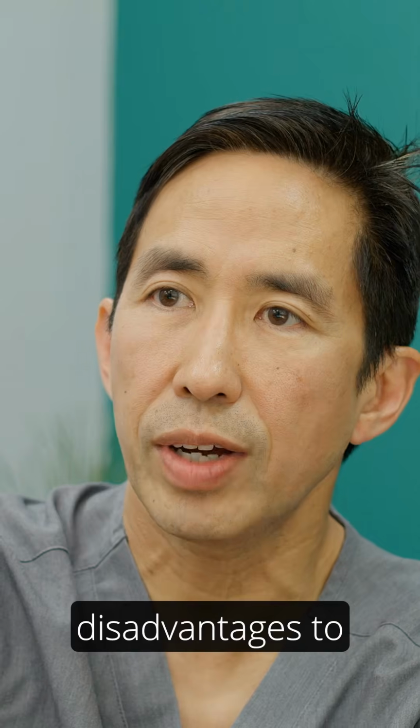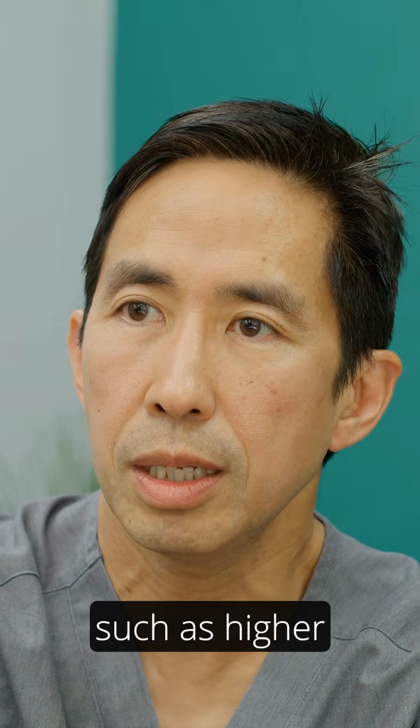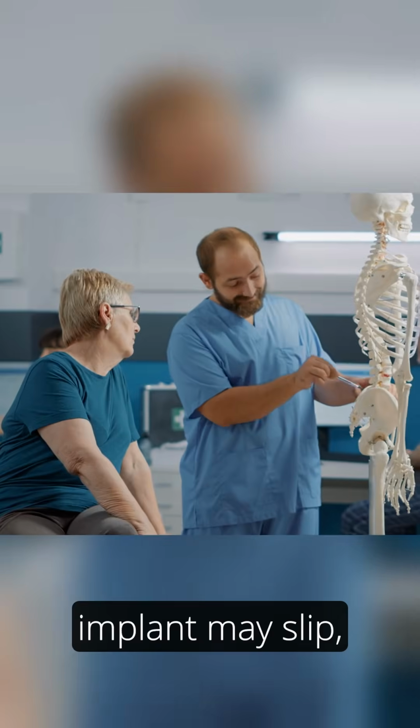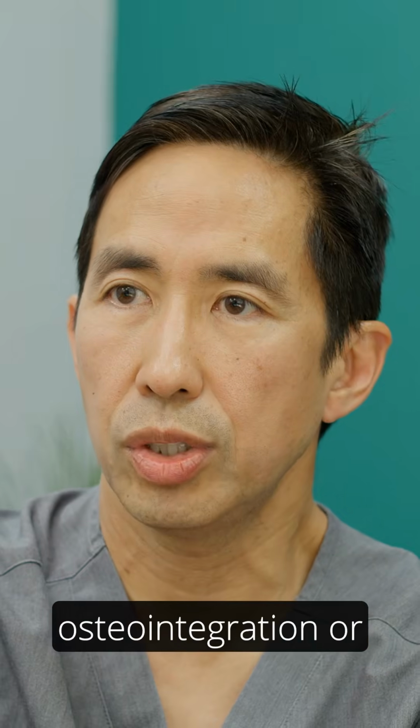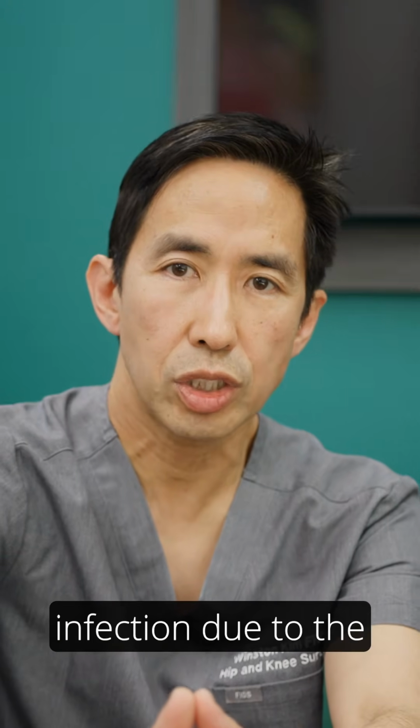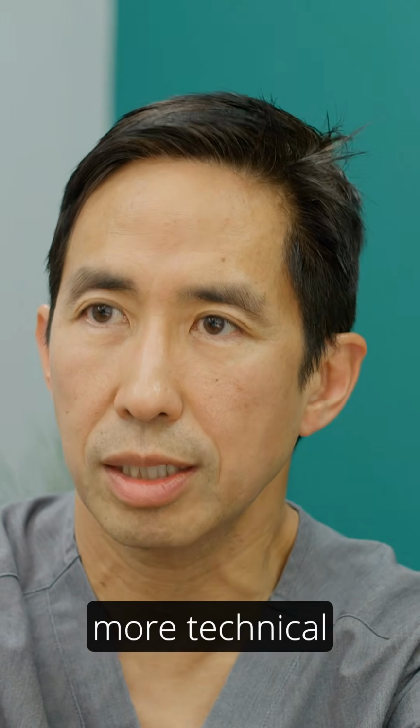However, there are disadvantages to anterior hip replacement, such as higher risks that the implant may slip, known as poor osseointegration or subsidence of the implant, and higher risk of infection due to the longer and more technical operation.